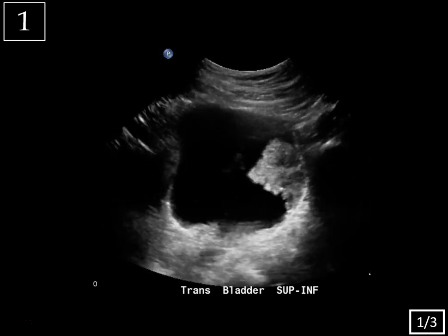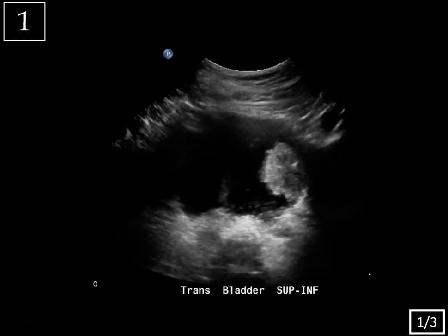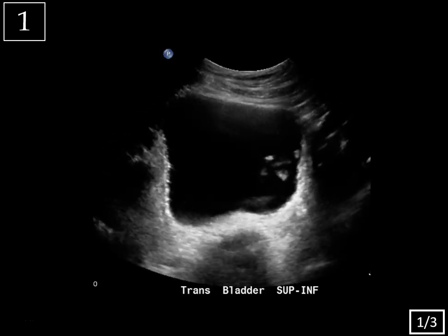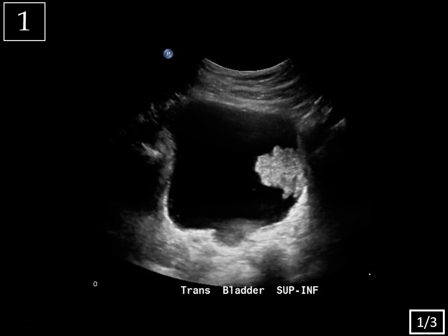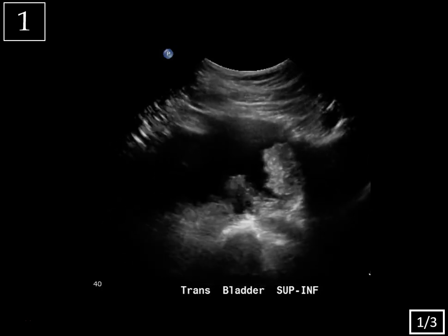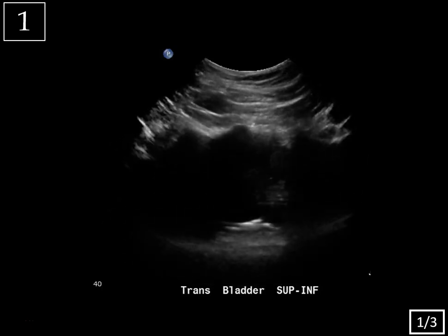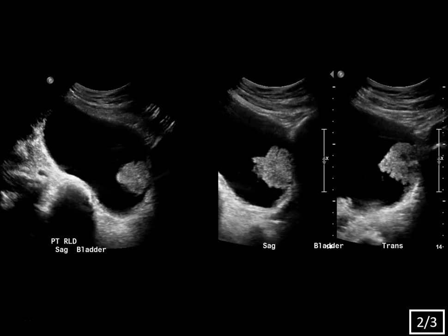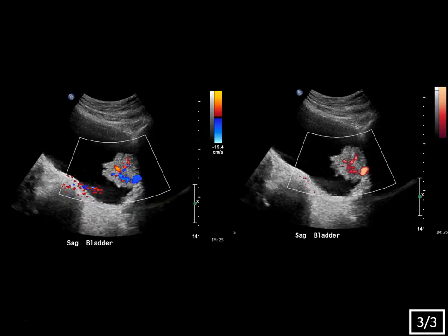Case one, slide one of three. This is a cine clip of the bladder. Slide two of three, showing some static images. That left-hand image is with the patient rolled. Slide three of three, color and power Doppler images.